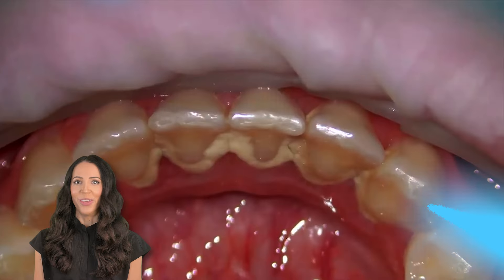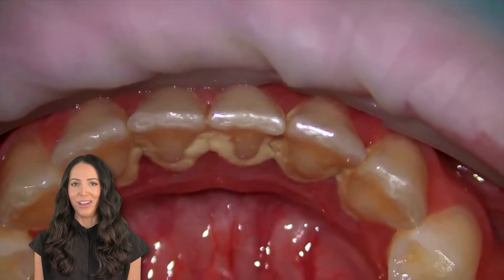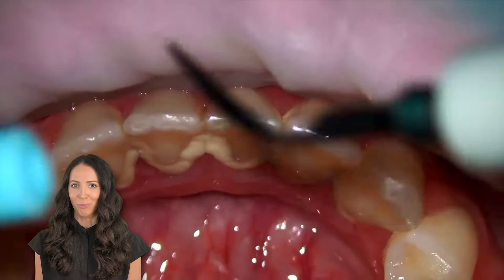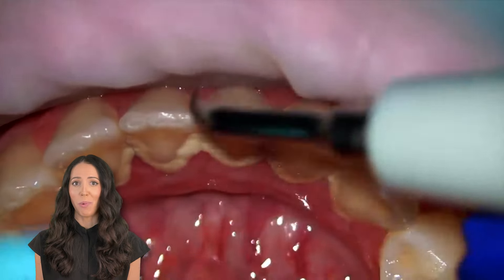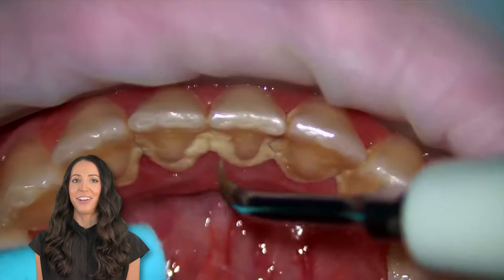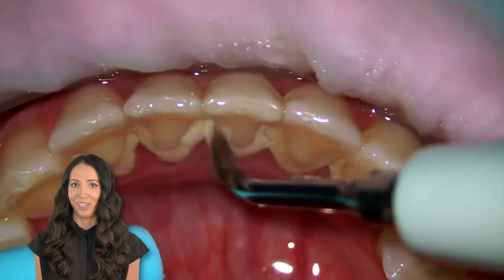For today's video, let's walk through a professional teeth cleaning appointment. So this is what dental professionals like to call a calculus bridge. Calculus is another name for tartar, and tartar is mineralized, hardened plaque. It's a rock-like substance that won't come off with regular brushing and flossing at home. As you can see here, to safely and effectively remove it from your teeth and from below your gums, you need a dental professional to scale it off for you.